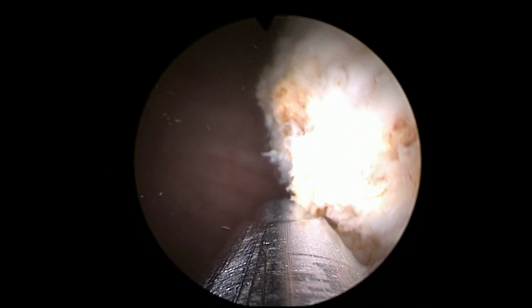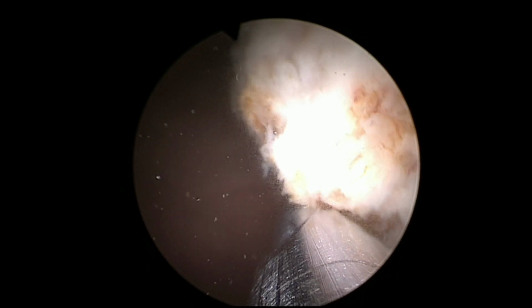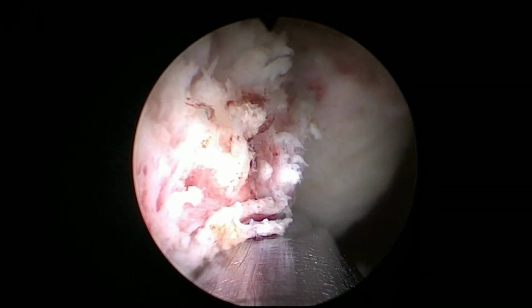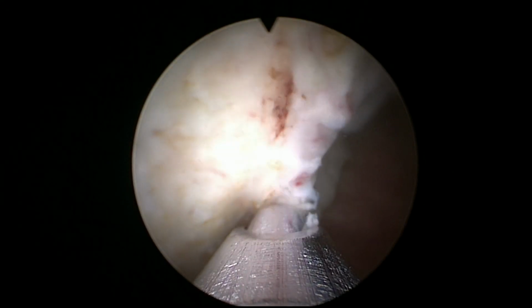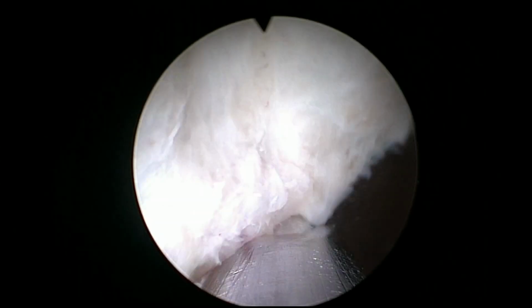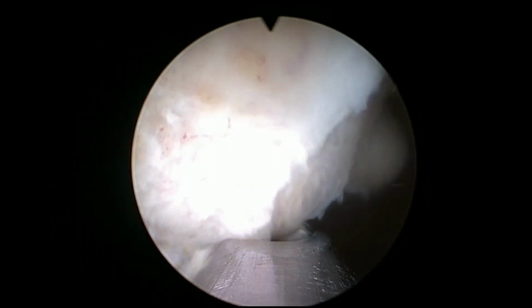In the initial moments, the morcellator has to be primed. The tubes have some air, so there is an initial moment where morcellation might not work. Of course, you can try to prime the system outside of the patient, like using a capsule on water. You can try to see what's going on, but there is some suction problem for the moment. Let's see. The first 5 minutes usually can be like this often, and then for some reason things start working better. Of course, hemostasis is important because it also adds safety to the procedure. If you can do your morcellation with such a good view, morcellation is much safer, of course.